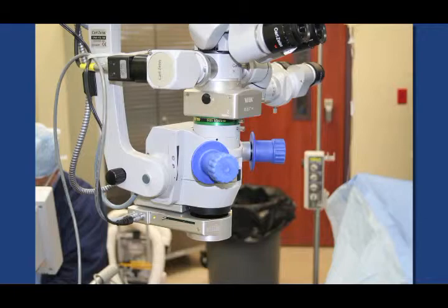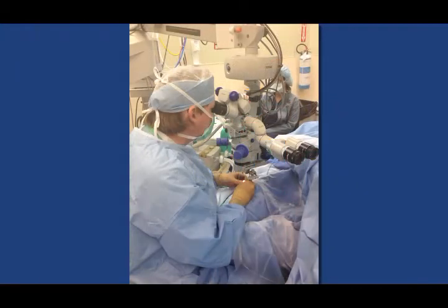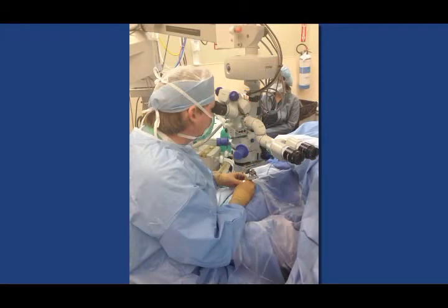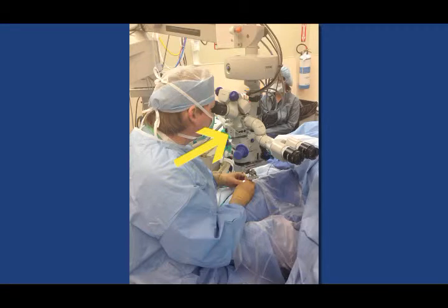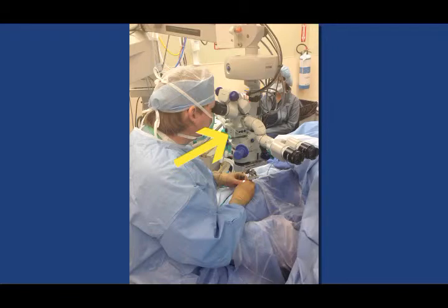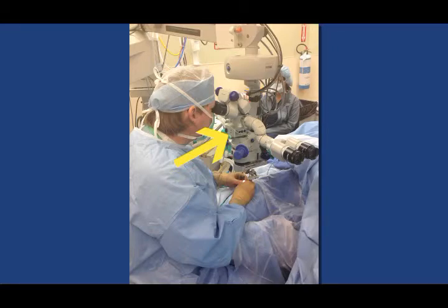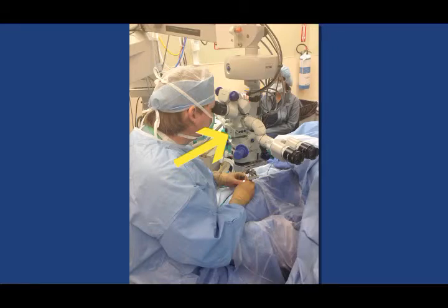However, if the assistant also requires a re-inverted image, then the Rolls Infinity must be installed below the beam splitter. This will re-invert the microscope's image before the beam splitter directs it to the physician and assistant.